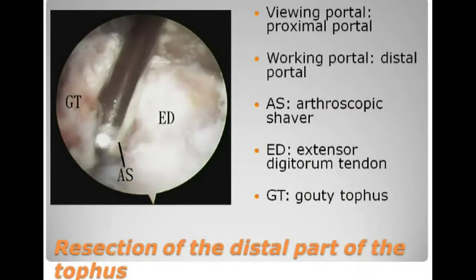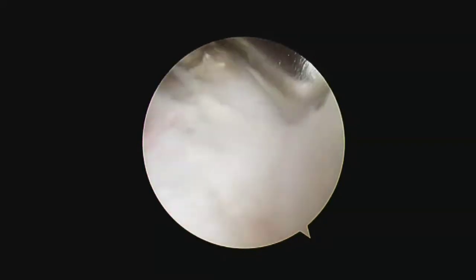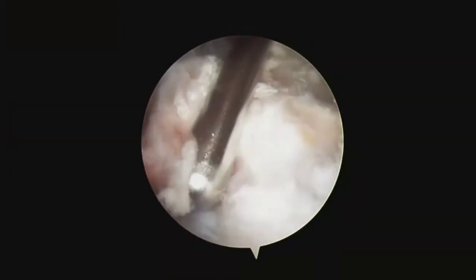After completion of the proximal part resection, the arthroscope is switched to the proximal portal and the distal part of the tophus is resected by means of an arthroscopic shaver and arthroscopic punch.